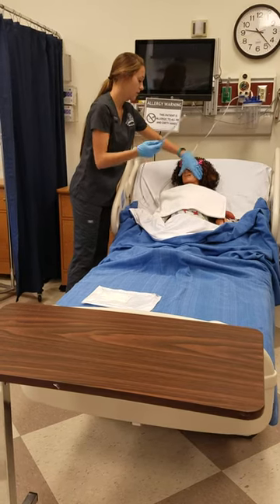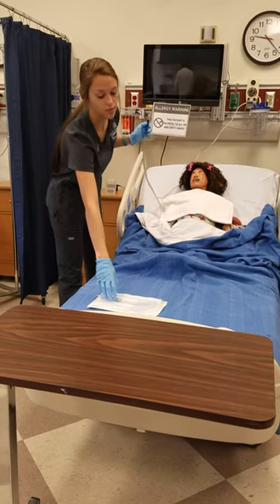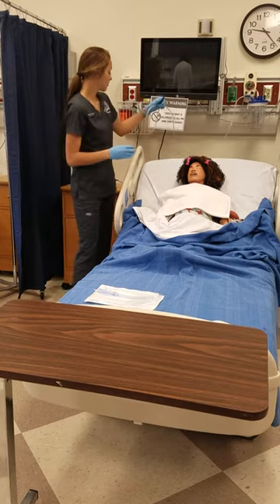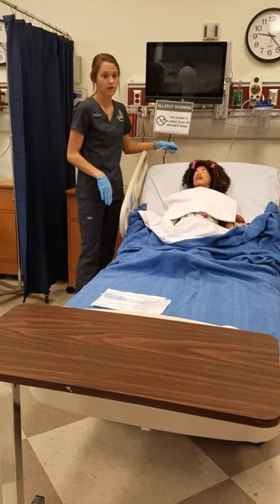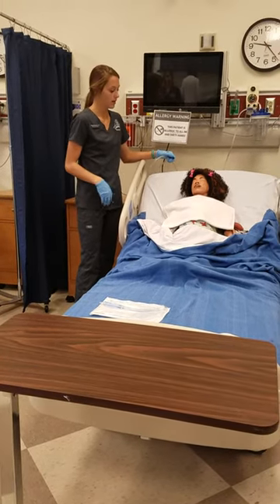Then I would take this off and put it back in the package and leave it in the room in case we have to use it again. I would turn it off, and I would ask the patient if they're doing okay and if they're comfortable. I would lower them back down, give them their call light, and document what I did.